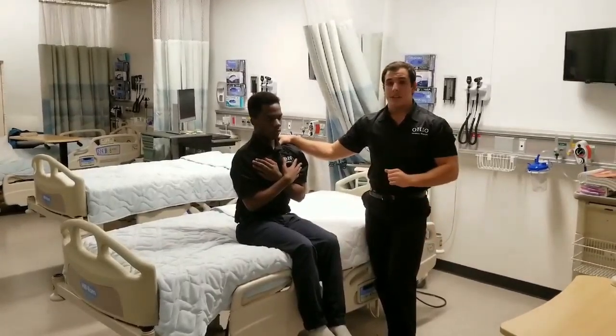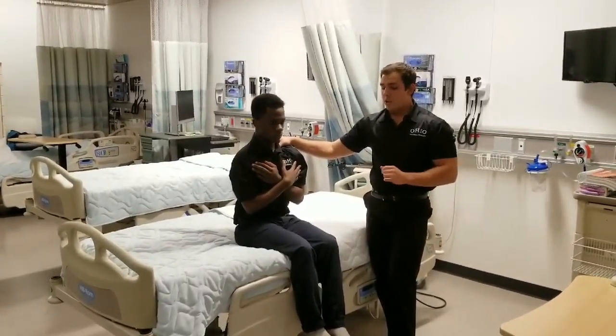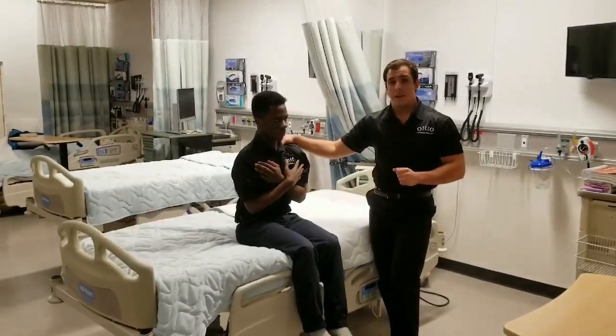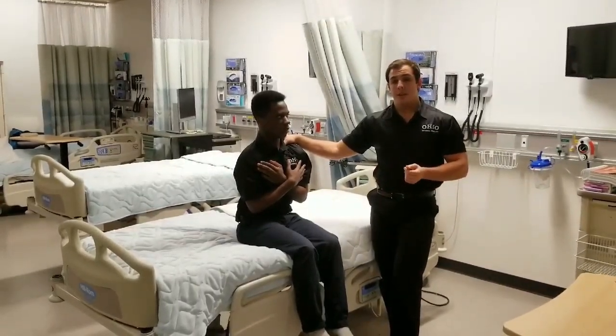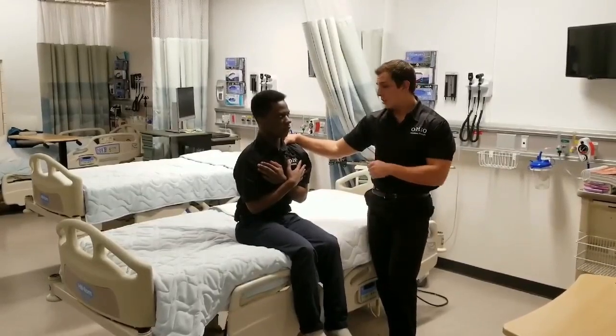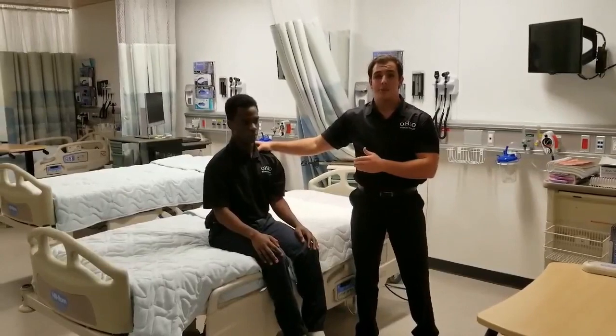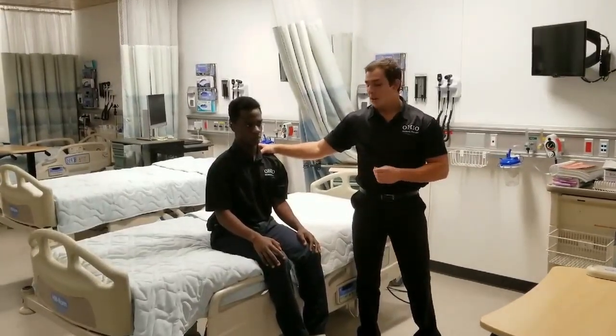The patient is now sitting at the edge of the bed, and at this point you may need to lower the bed so that the patient's feet are on the ground, and you'll also want to make sure the patient is comfortable in this position. Are you comfortable right now? Okay.